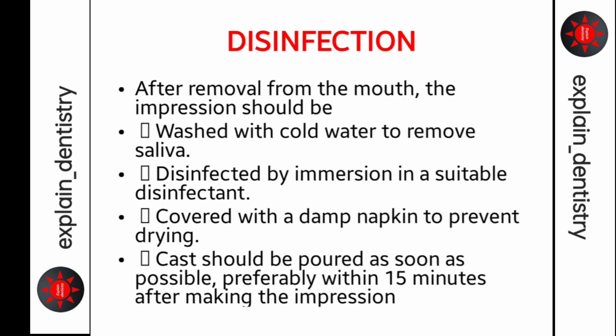Disinfection. After removal from the mouth, the impression should be washed with cold water to remove saliva, disinfected by immersion in a suitable disinfectant, and covered with a damp napkin to prevent drying. The cast should be poured as soon as possible, preferably within 15 minutes after making the impression.